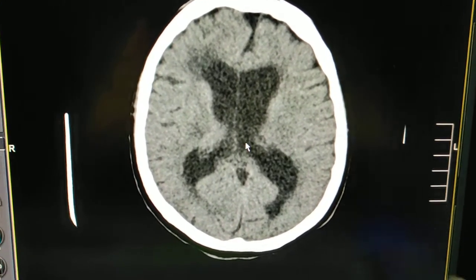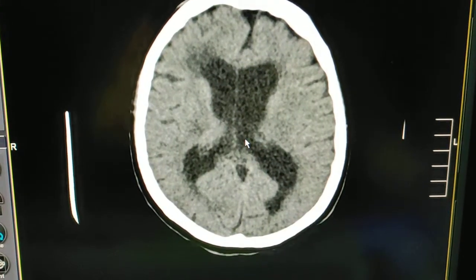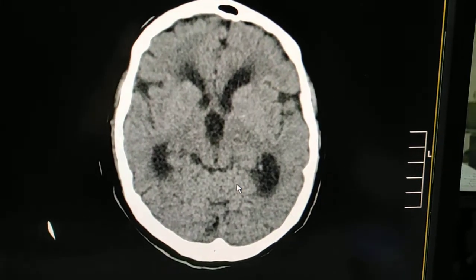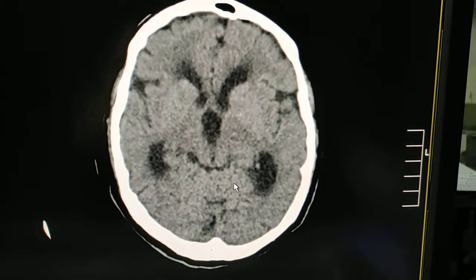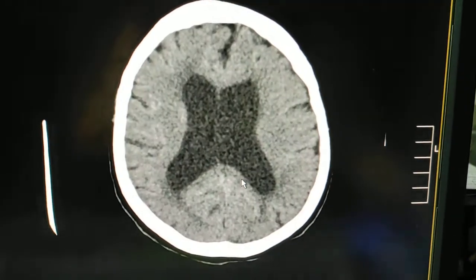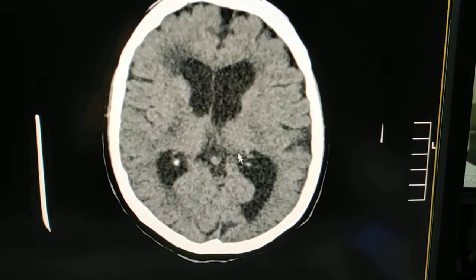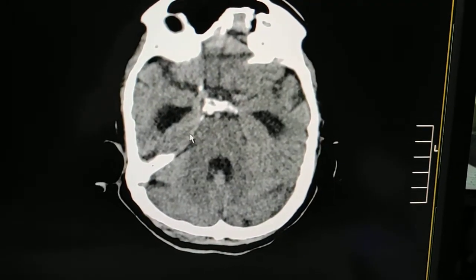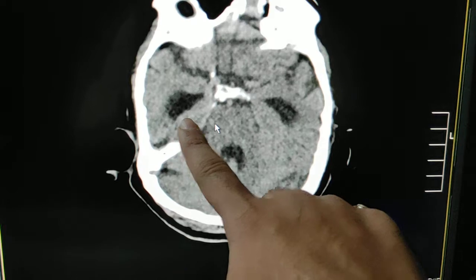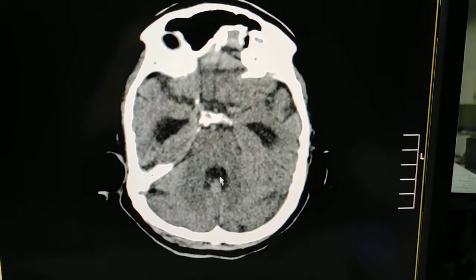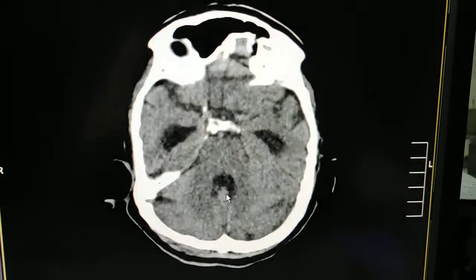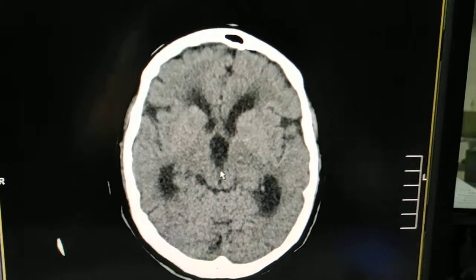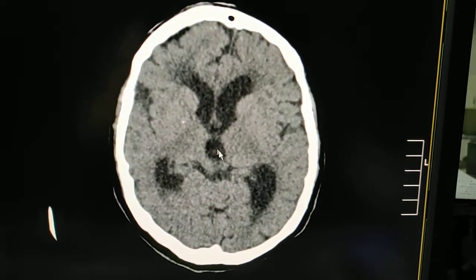What is NPH? These are the ventricles — both lateral ventricles and the third ventricle — filled excessively with cerebrospinal fluid, causing pressure on the brain. This is called NPH. You can see the temporal horns of both lateral ventricles are dilated. This is the fourth ventricle, which is also prominent.